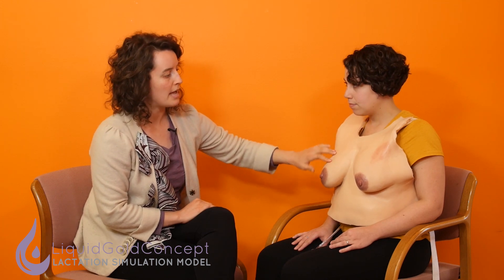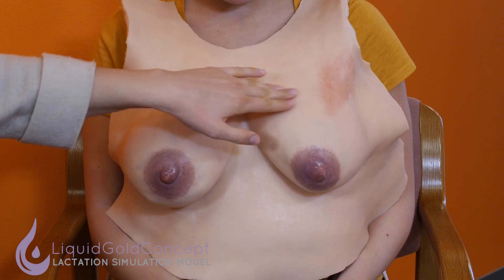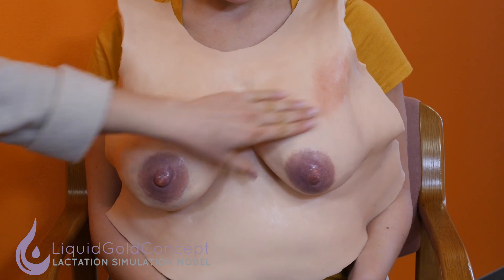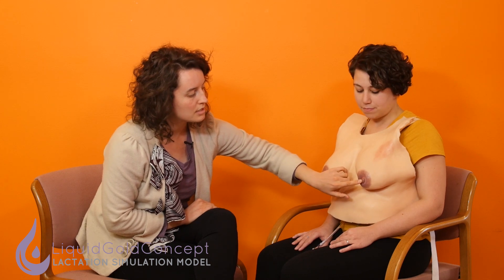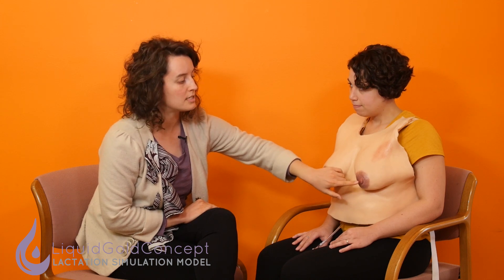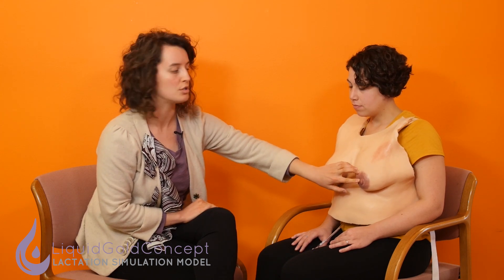The other features we have are early stage mastitis. You can see the reddening of the tissue here, and then of course we have a little fissure on the nipple, which is really to demonstrate the severity of the shallow latch. We don't have a bleeding nipple here yet, but it's something that may have occurred in the past due to the mastitis, or it's something that could get worse in the future. So you can really tailor your cases to what you want your learners to learn.